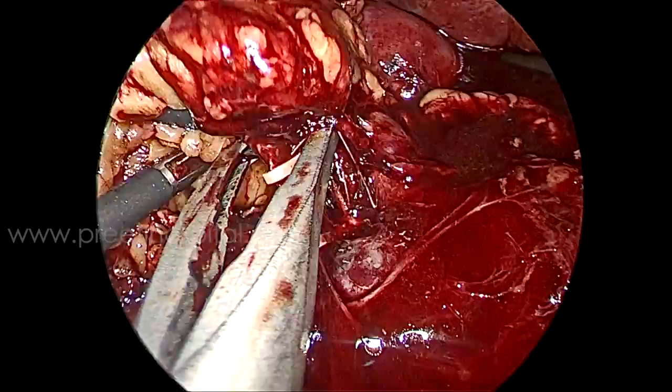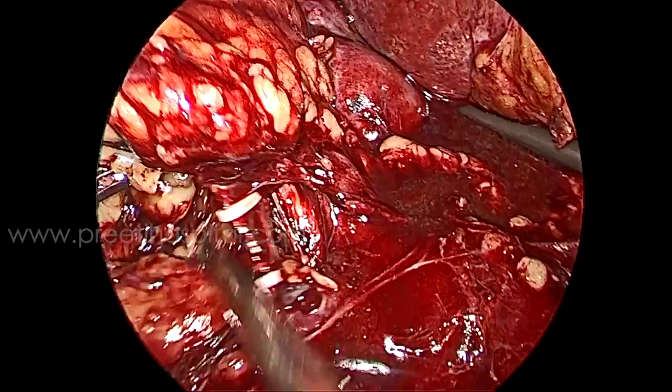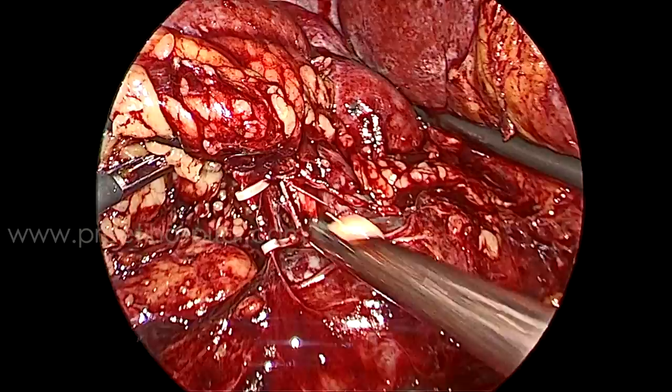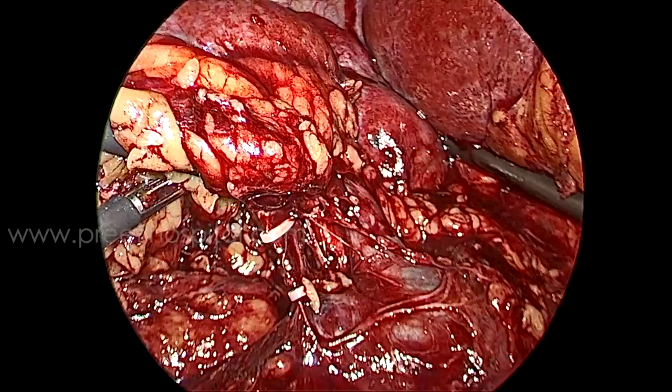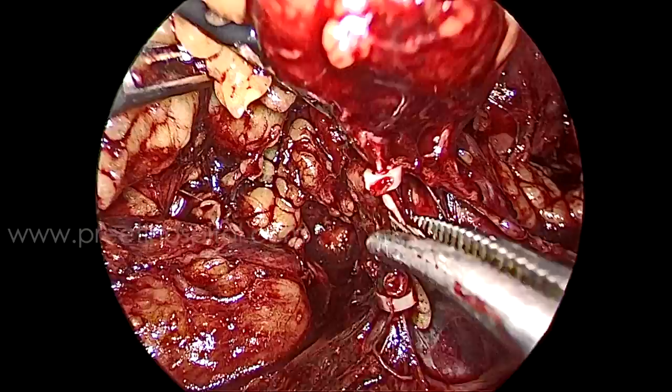I applied a clip distally, then removed the original clips one by one — you can see they come off easily. In between two clips I applied another because I am sacrificing this vein. My job is to come out safely — whether I can do partial nephrectomy or not is doubtful with such a big vein that can drain almost like a full renal vein. I removed the clips with Maryland — just hold and pluck out; they come out easily.